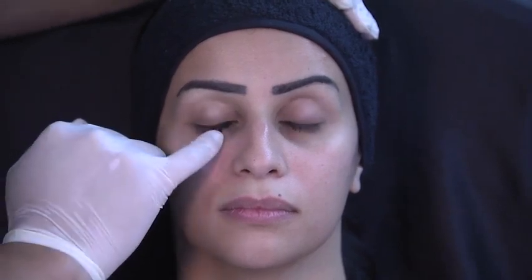So this is patient number 2. Remember, we have injected Volume in the first patient, Define in the second patient, Refine in the first patient, and Vital Light in this one. So we're treating different patients with different products, real personalization. That is the essence of personalization with this portfolio, and you're showing that in a very great way.